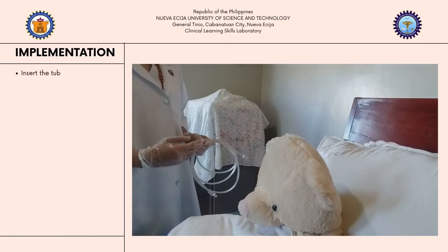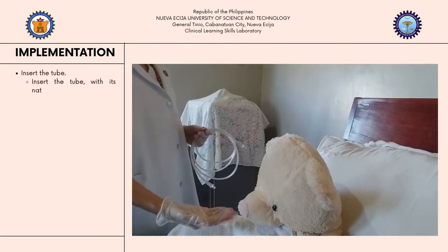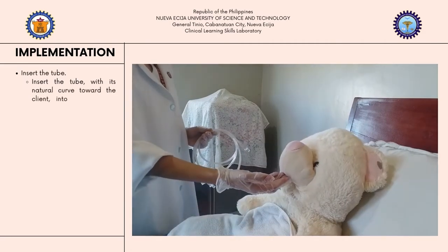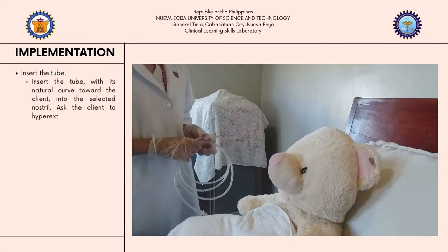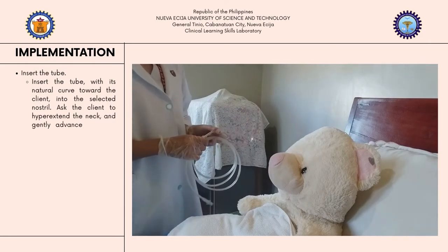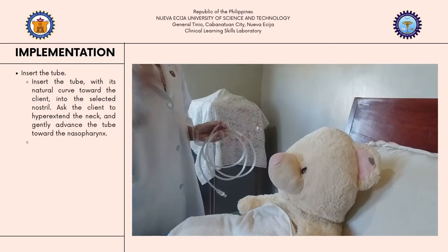Now, insert the tube with its natural curve toward the client and into the selected nostril. Ask the client to hyperextend the neck to lessen the curvature of the nasopharynx, and then we're going to gently advance the tube toward the nasopharynx. Okay, ma'am, I'm going to insert the tube right now. And remember that if you feel anything, you can just raise your hand to tell me.